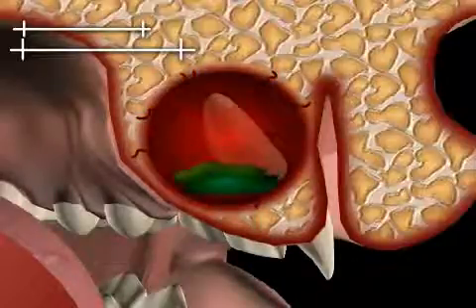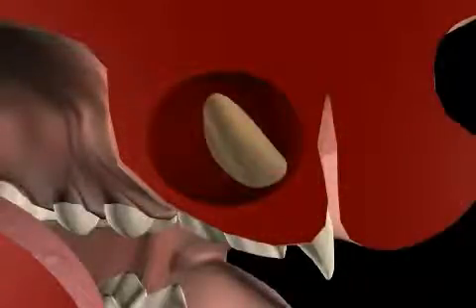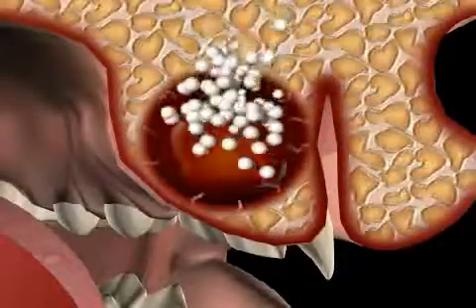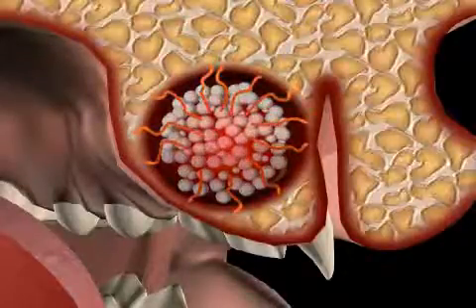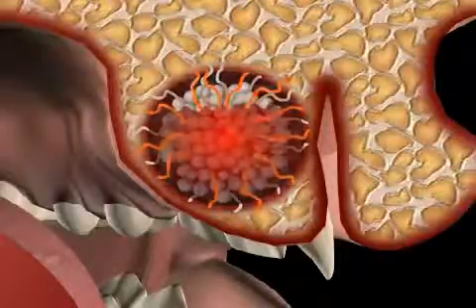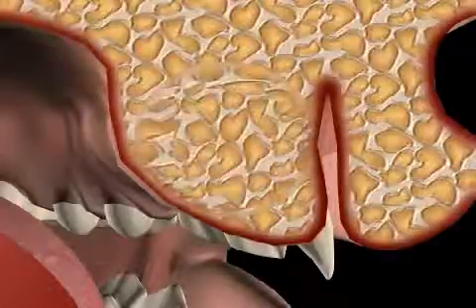In order to avoid this complication in the case of large cysts, it's common to try and stabilize the coagulated blood and to reduce its contraction, for example, by filling the hole in the bone with a granulate made up of bone replacement material, as can be seen here. In this way, a contraction of the clot is inhibited, blood vessels can grow in from the walls, and the foundation has been laid for the subsequent regeneration of the bone.